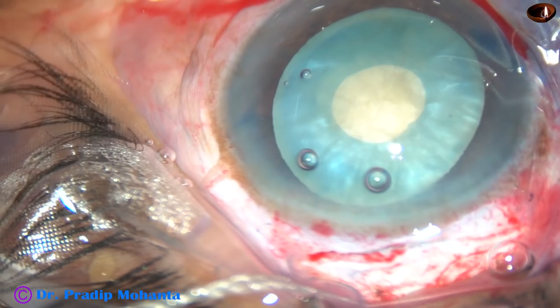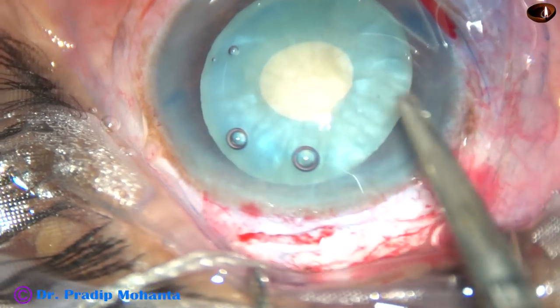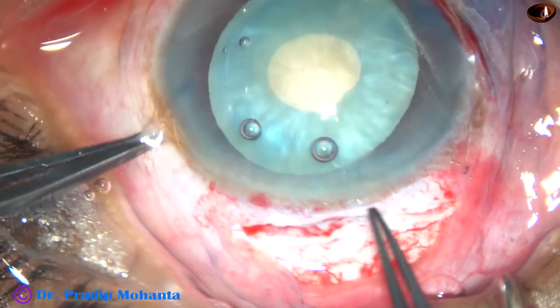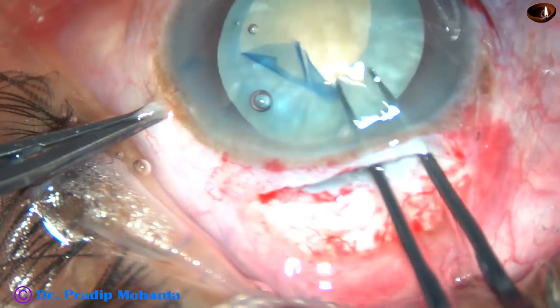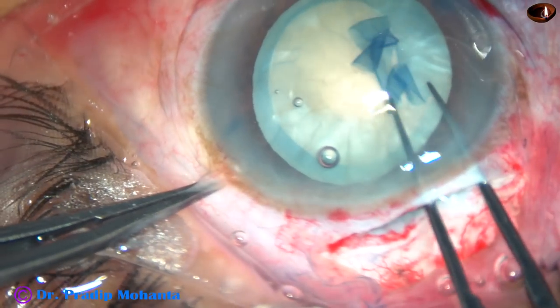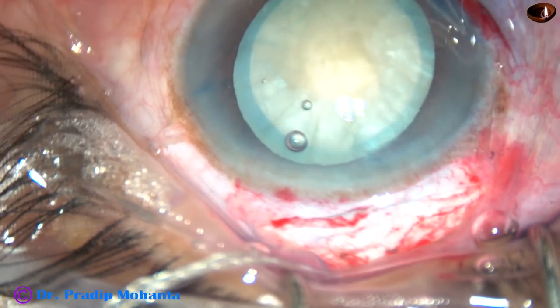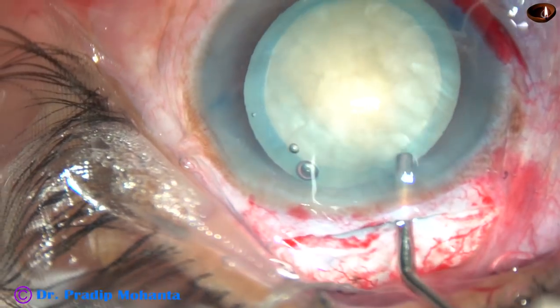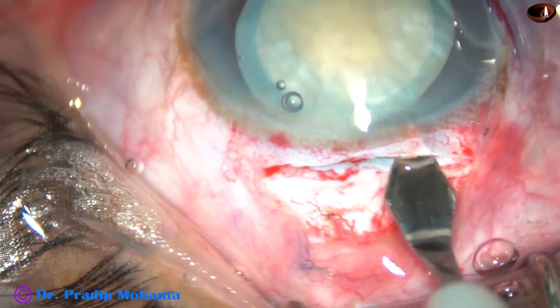The cohesive viscoelastic substance has been injected again. Now I take a Vannas scissor and make this small nick. Then I take the utrata forceps again, hold this small capsular tag, and enlarge it. In intumescent cataract, if you want to place the intraocular lens in the capsular bag, this should be the approach.